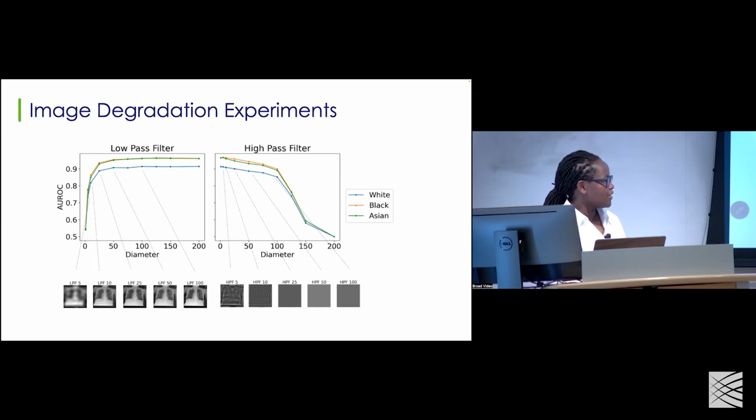And so this ability, one that doesn't take long and persists on degraded images, is a big issue and still remains. I will show you some subsequent work, but it's really what made me pivot and start to say, maybe there are hidden signals. We don't know if they're confounders or shortcuts or whatever they are, but the models are able to detect them. And unless we understand this phenomenon, and I will show you subsequent examples, we're not going to be able to mitigate any bias or make AI that is actually clinically useful.